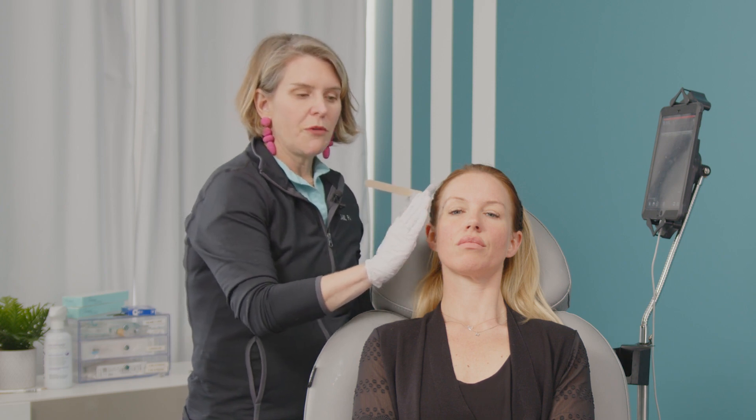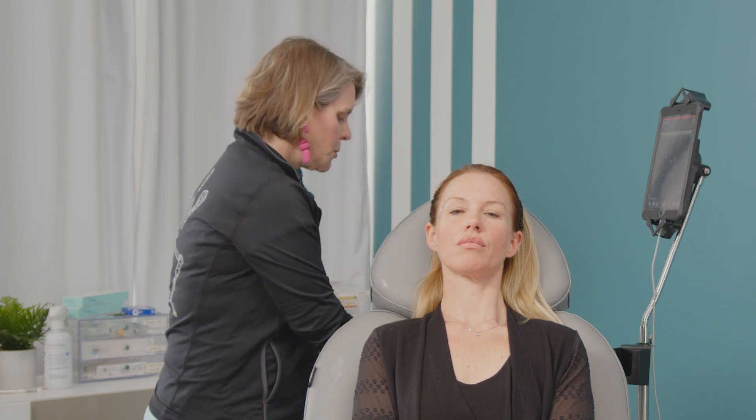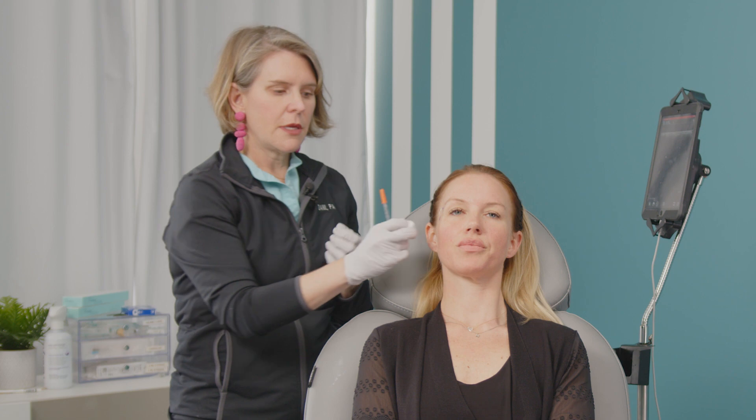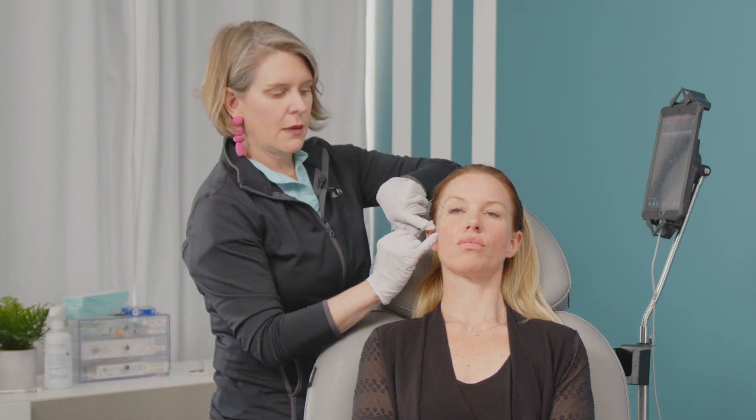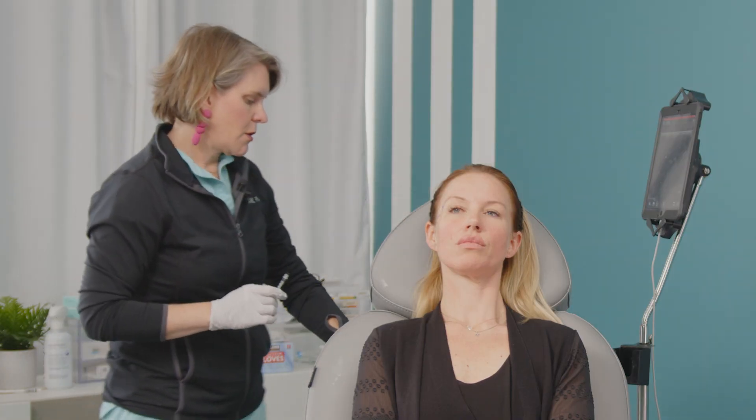For layer two, we're going to go really superficially. Because we've plotted out the bottom of our probe, that's where I'm going to put a little wheel of lidocaine — that's where my cannula is going to enter. Just a tiny little poke, Nikki — just a little bit of lidocaine. And that's where we're going to enter.